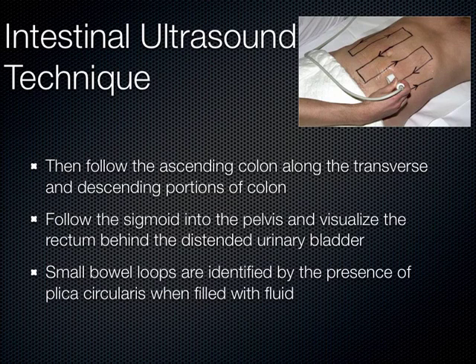When I'm doing a focused appendicitis exam, which I do quite often in the ER, I keep this mowing the lawn technique just around the right lower quadrant where the appendix is located, what we call McBurney's point. Or sometimes I just hand the transducer to the patient and say, put this where the pain is. And then they start to push it on their abdominal wall, and they help to localize where I should start my search for the etiology of their pain.